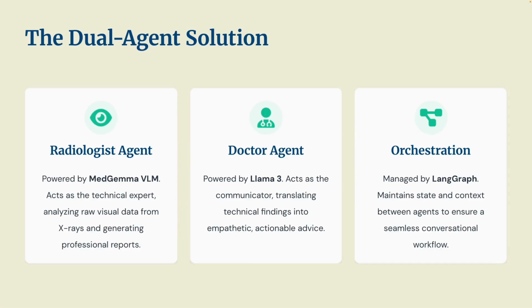To solve this, we built a dual agent system. First, we have the radiologist agent, powered by the MedGemma vision language model. It acts as a technical expert, analyzing the raw image. And second, we have the doctor agent, powered by Llama 3. It acts as the communicator, translating those technical findings into empathetic, actionable advice for the patient.